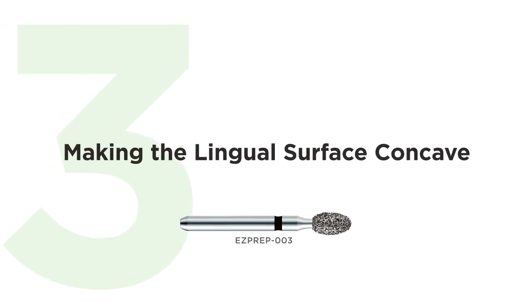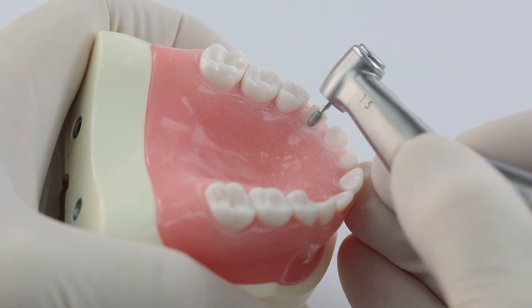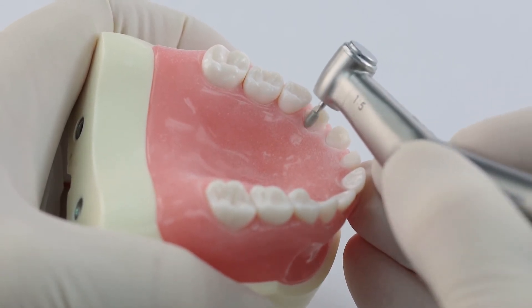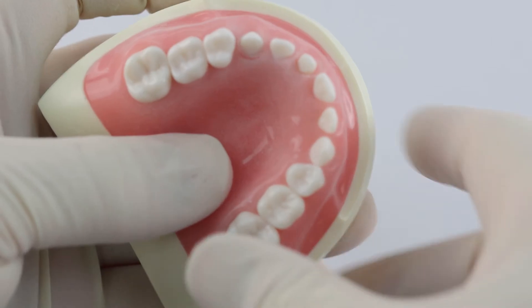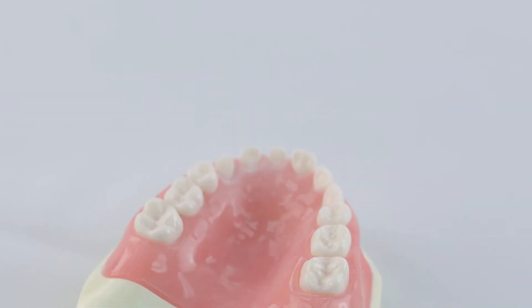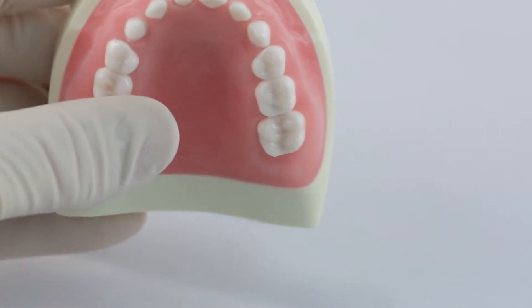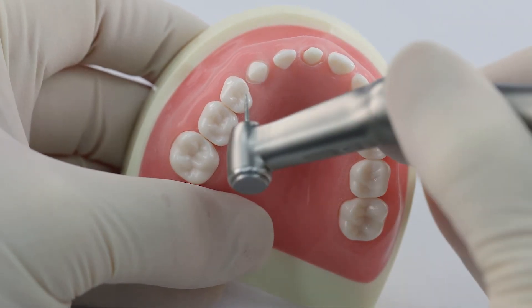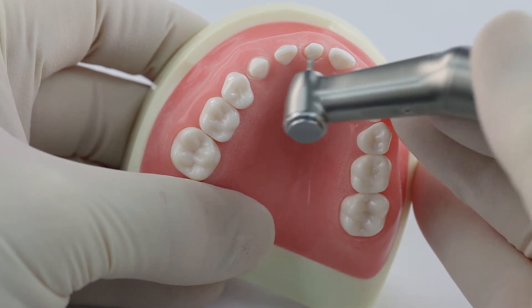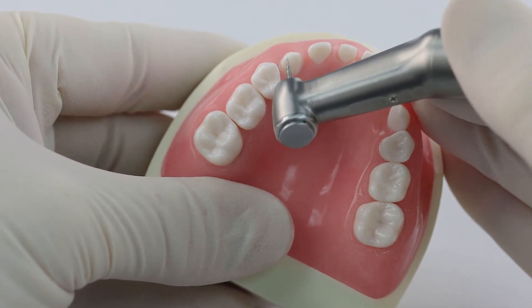Now we're going to do the lingual reduction. All you need to do is make the lingual surface concave — not a lot of reduction there. But the important thing is to carry the lingual reduction up to and including the incisal edge. That is what creates your thin incisal edge that follows the arch form. So you can see we have a thin incisal edge created by two things: the second plane of reduction on the buccal, and carrying the lingual reduction up to including the incisal edge.